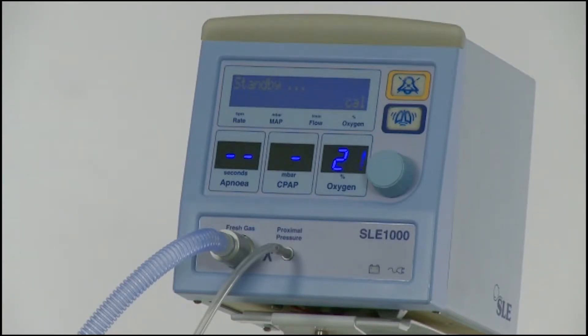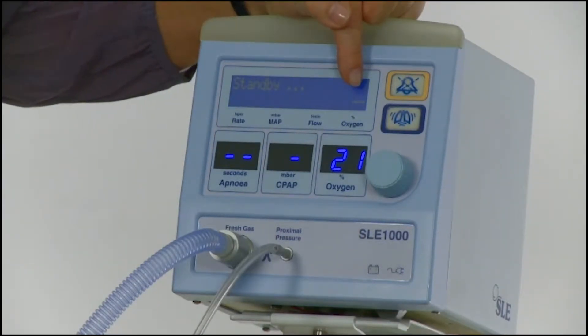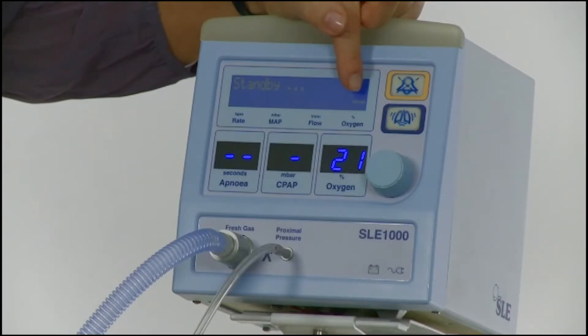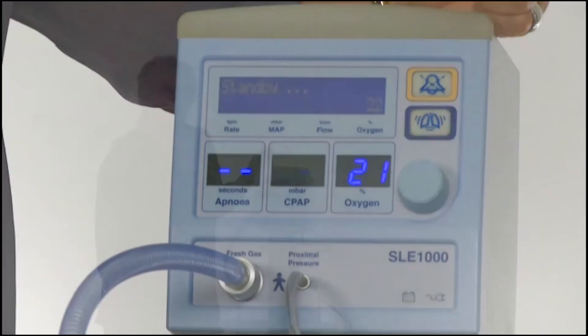Once the 100% calibration is completed, the small CAL will be replaced by two dashes in the bottom right-hand corner of the LCD screen. Once complete, the two dashes will then be replaced by the measured oxygen value.